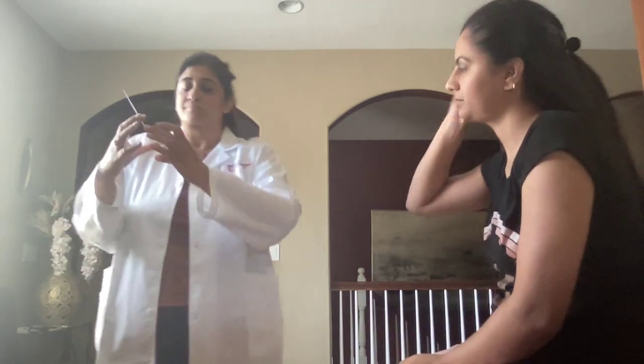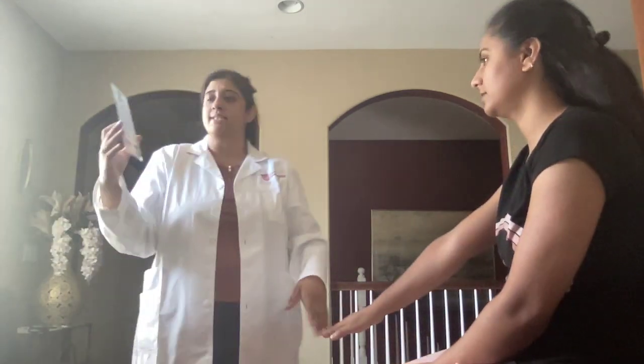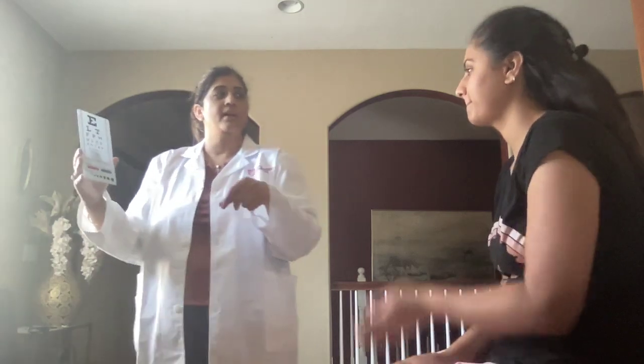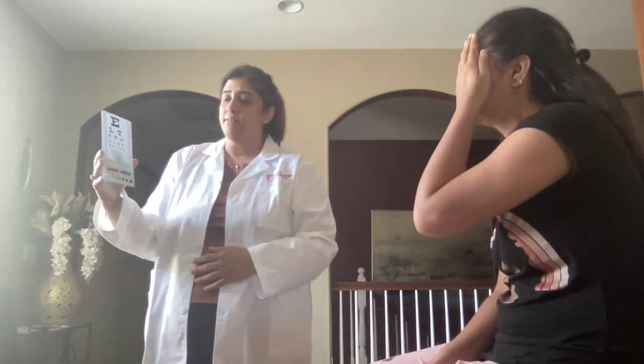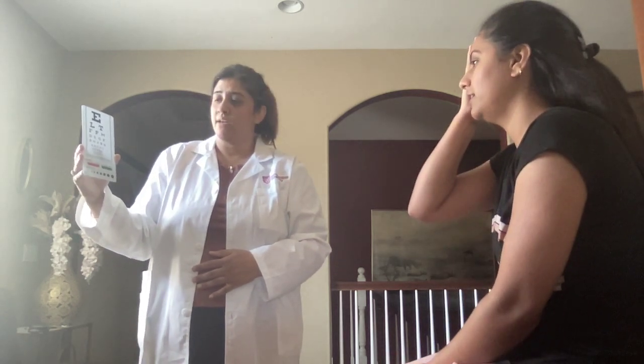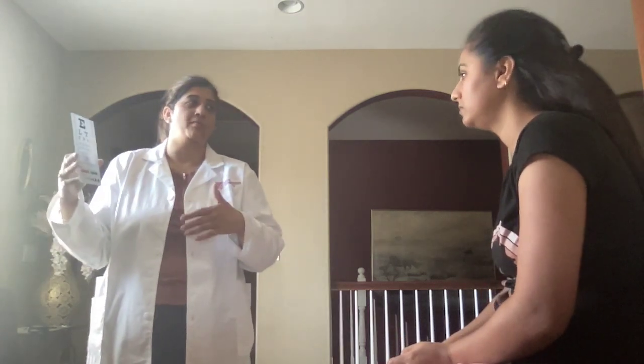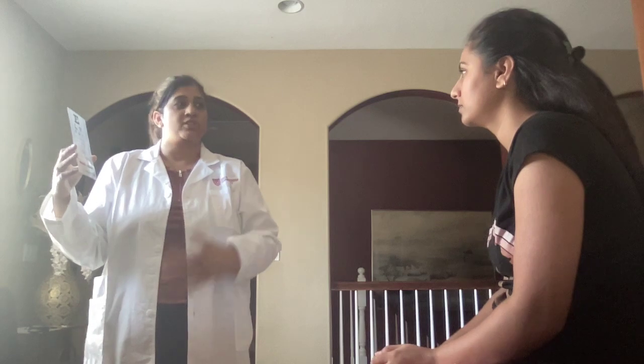At a distance of about 6 feet, this is called a pocket Snellen chart. I'm going to have you cover one eye and read the bottom line. LTFPH. Okay, cover your other eye. Read LTFPH. Okay, with both eyes. LTFPH. So your vision is 20/20. The top number indicates the distance at which the patient reads the chart, and the bottom number is the distance at which the normal eye would read. So your vision is 20/20.